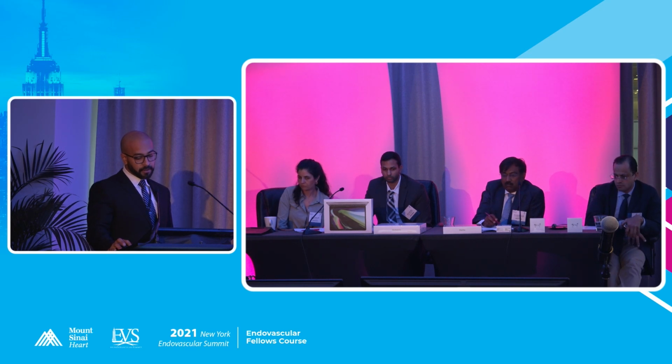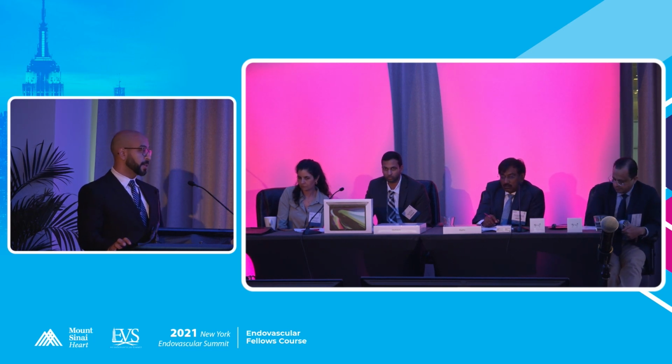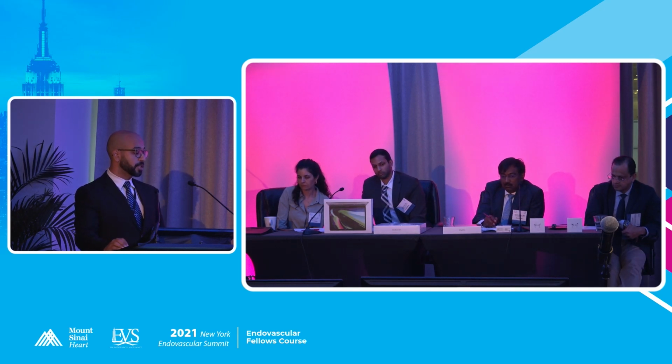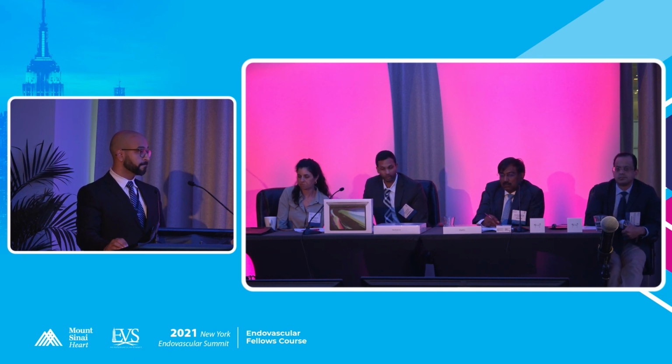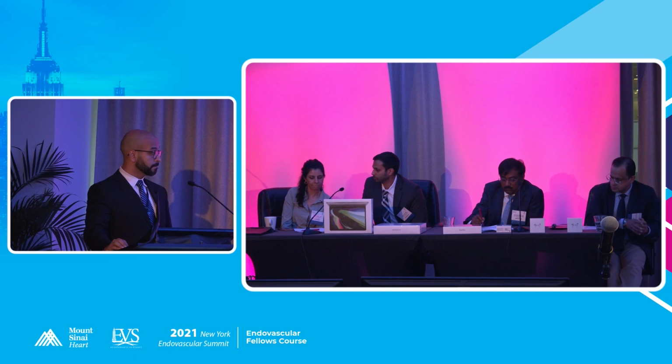And so even though the dissection is not within that region, there is thrombus within that aorta. And I believe that if we truly wanted to avoid this, the patient would have had to undergo that zone 0 bypass from the beginning of it, which just would have never happened given the rupture situation that she was in. Very nice case. Quick question: how did you size your first stent graft?